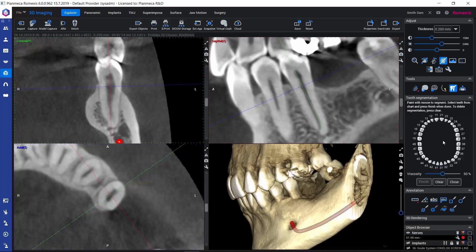We can activate the tooth segmentation tool here in the toolbar. Here we get the tooth chart and we can pick the number for the tooth that we're going to segment — 35 in this case — and then we can do the segmentation. The segmentation is done by painting all the volume that will be part of the tooth and that will become the surface model.